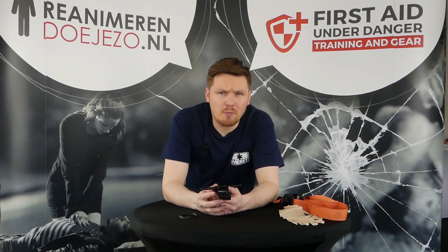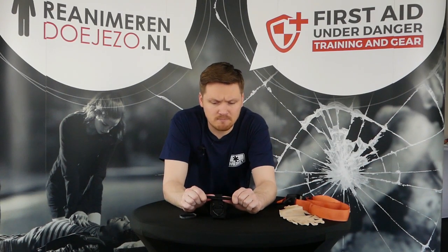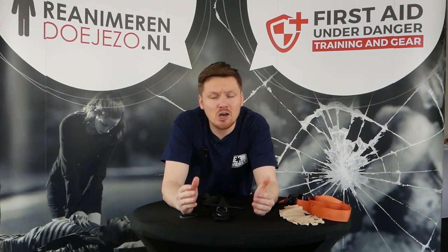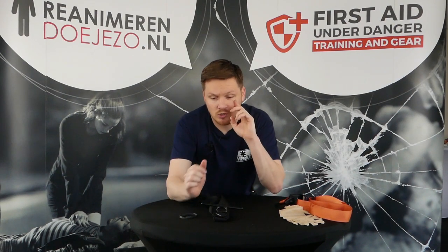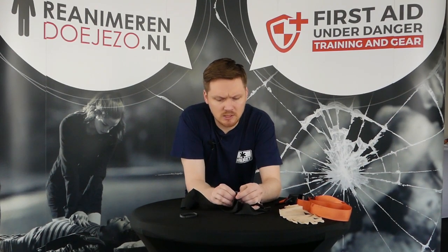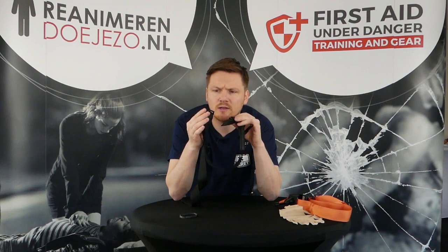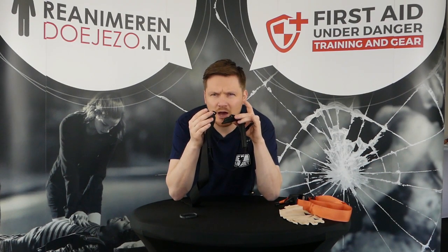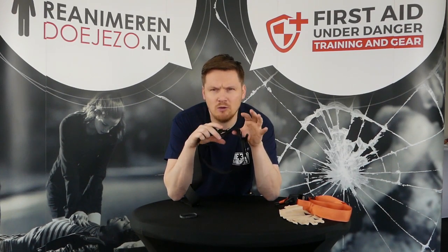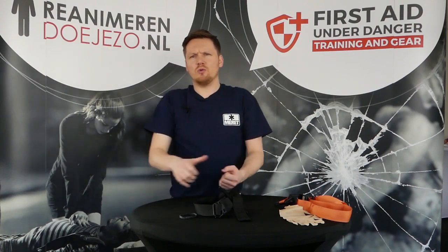And the reason is quite simple. It's made of plastic, so it tends to bend much quicker than this. This is, even though it's much narrower, if I try, I cannot bend it because it's much stronger. So that is always an upside for the SOF-T. You can easily unbuckle it still, the same as you could with the Generation 3 SOF-T. So I do believe that is something that helps, especially if you are, for example, an EMT or a medic, and you want to place the tourniquet on somebody's arm or somebody's leg. You won't have to get it all the way out.